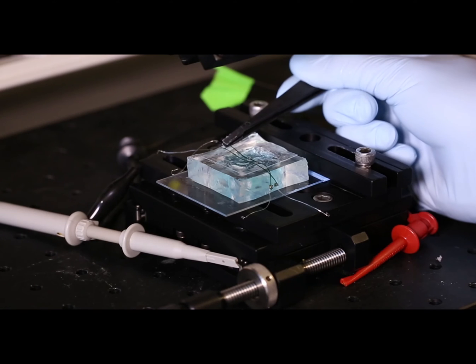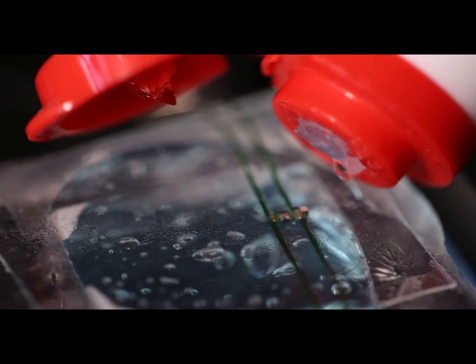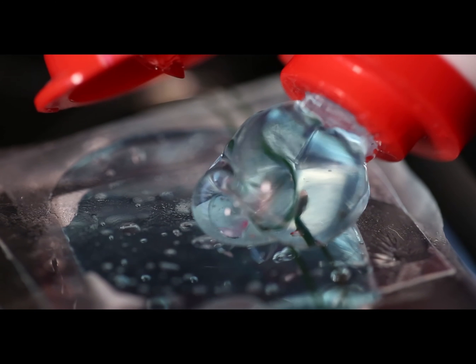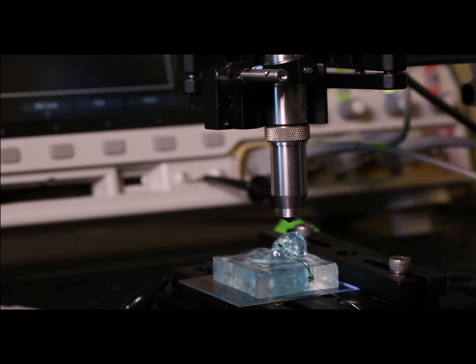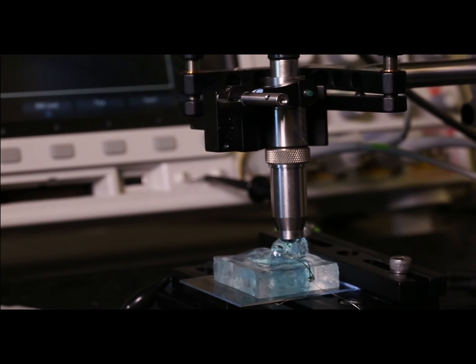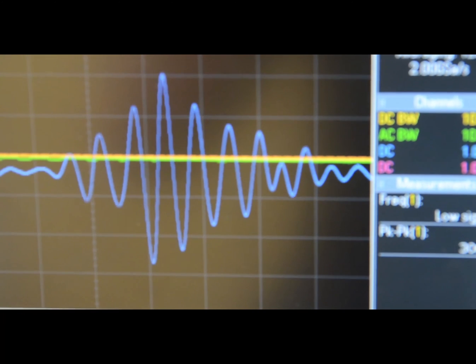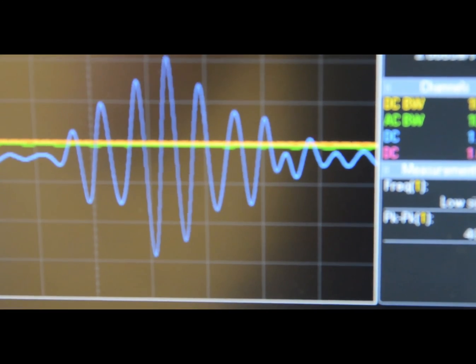Before being implanted in an animal, each fabricated neural dust implant, or mote, is tested on a benchtop setup. The mote is mounted on the acrylic stage and the transducer and the mote are fully aligned. In order to confirm backscatter communication, artificial neural signatures can be introduced into a water tank and changes in backscatter amplitude should be apparent.